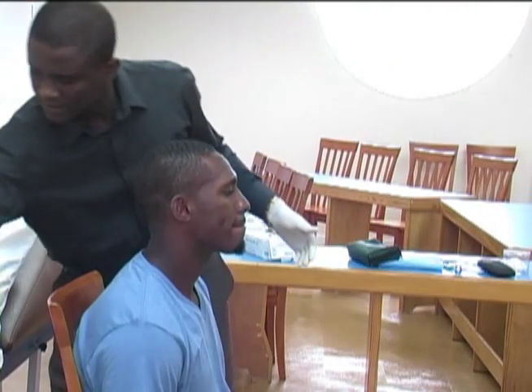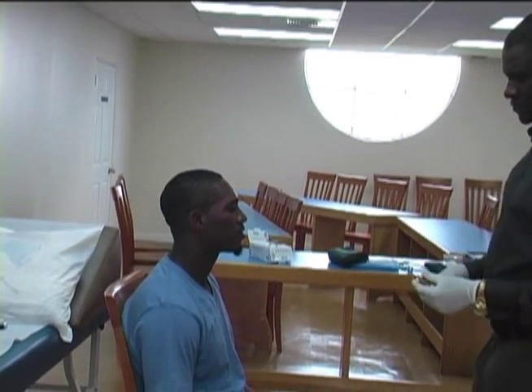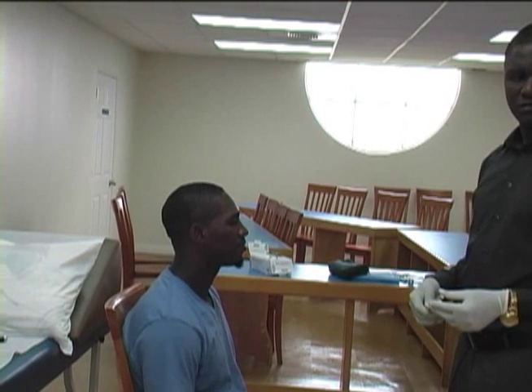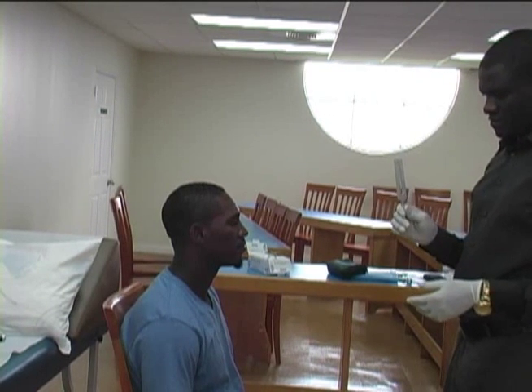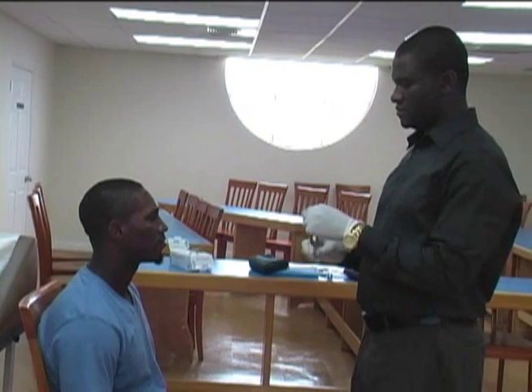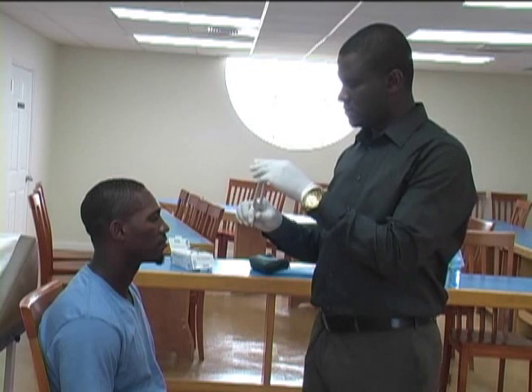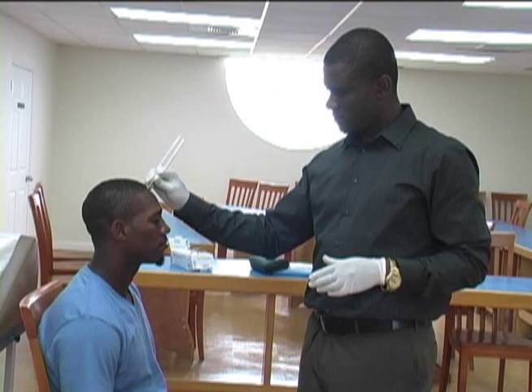The Weber test. This is useful when hearing loss is asymmetric. Weber tests hearing ability by bone conduction in both ears. Hold a 512 Hertz or high frequency metal tuning fork by the stem with one hand and set the tuning fork vibrating by forcibly pinching the prongs of the tuning fork with the fingers of the other hand and then pulling the hand away while trying to maintain the grip.